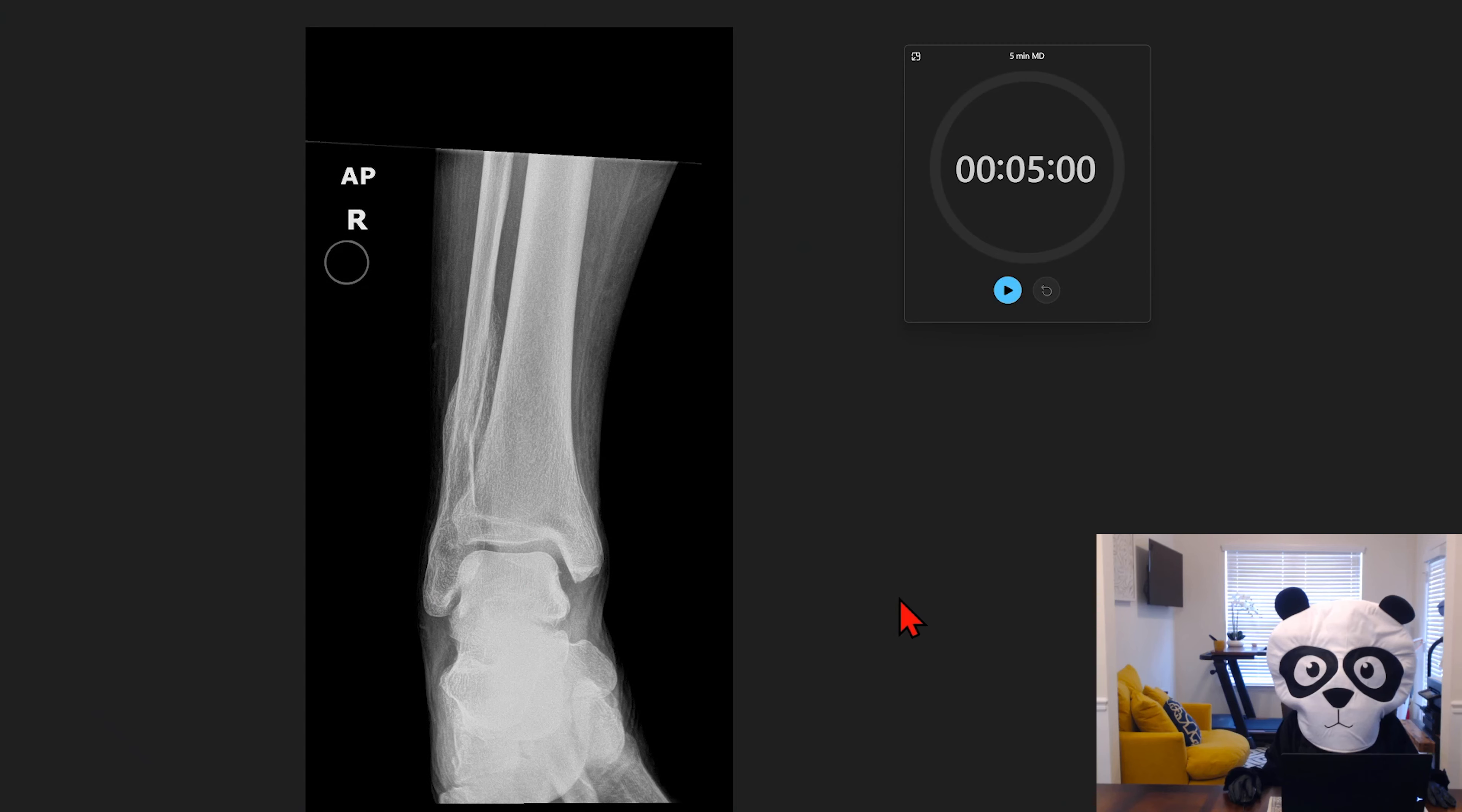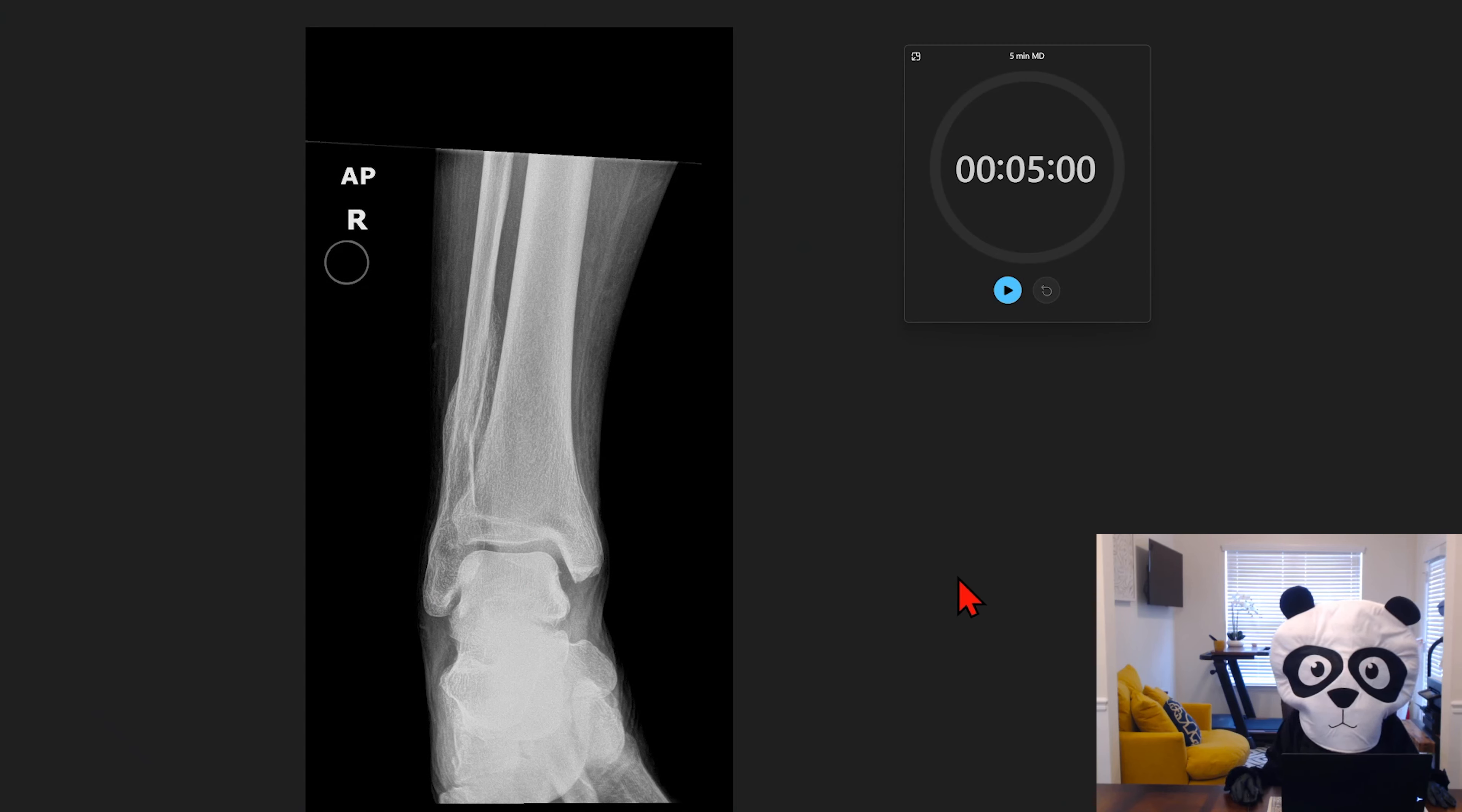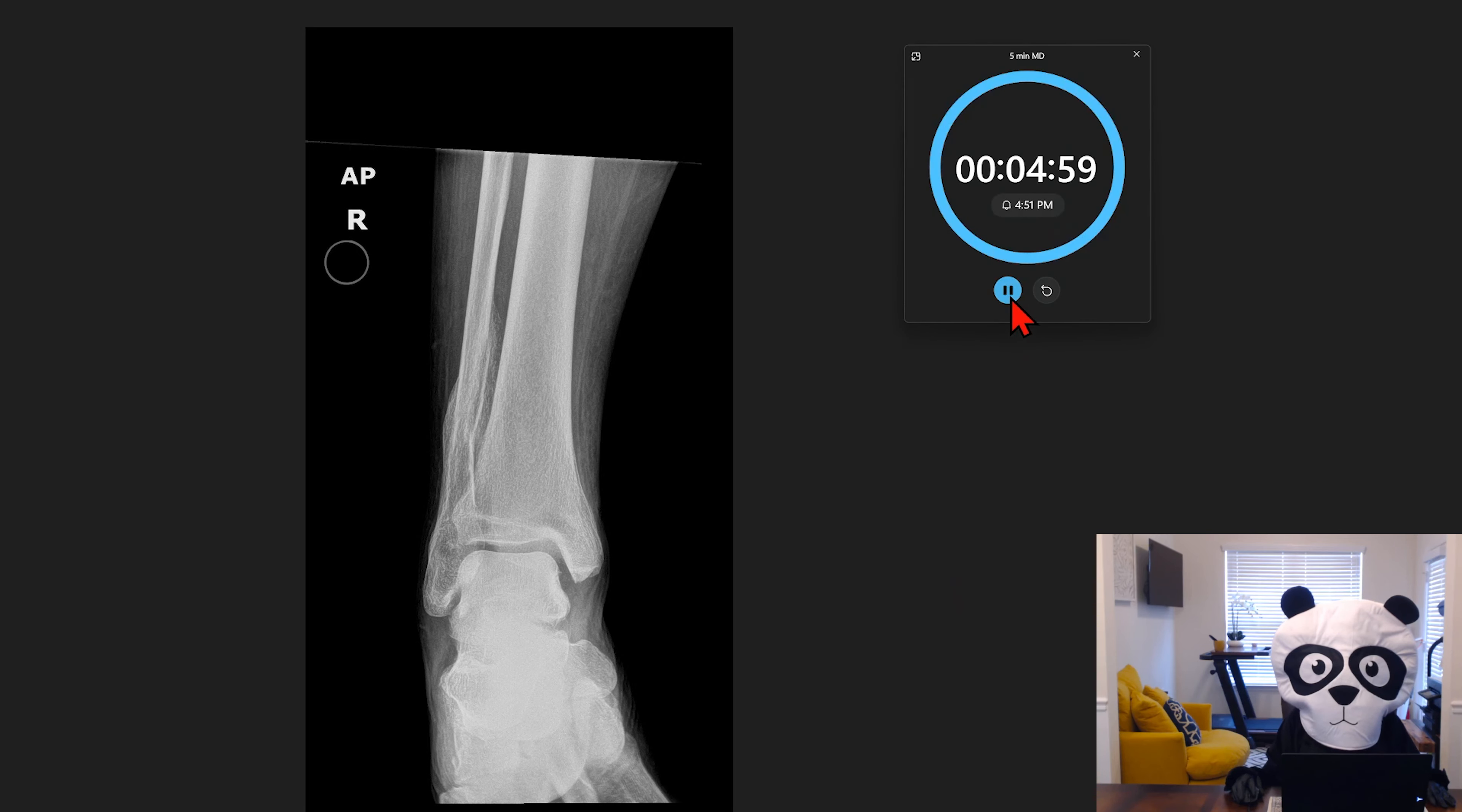Hey guys, welcome back to the channel. Today we're going to be taking a look at an AP view of the right ankle. Let's go ahead and start our timer.